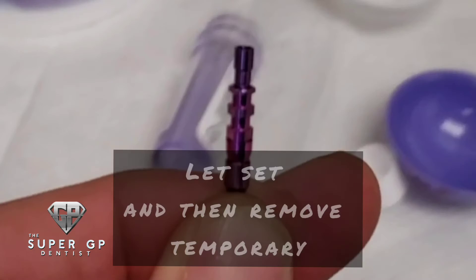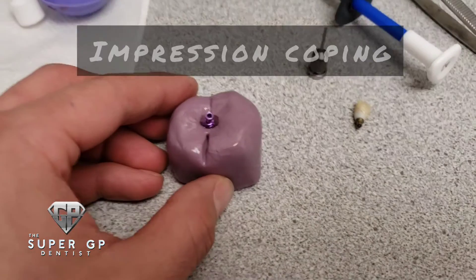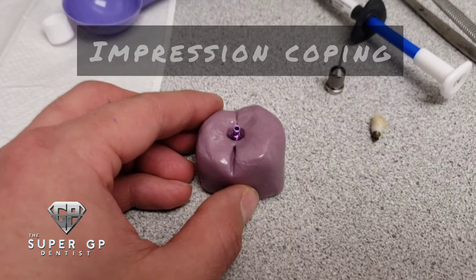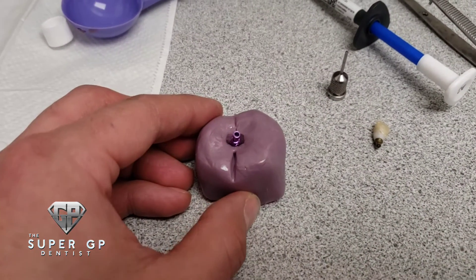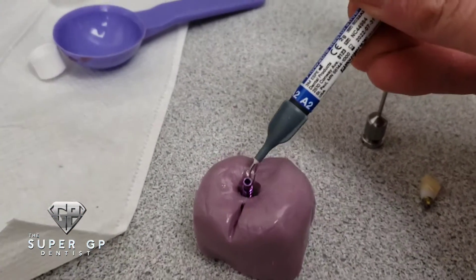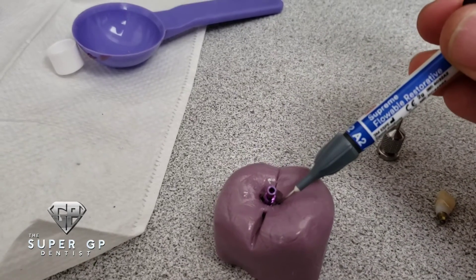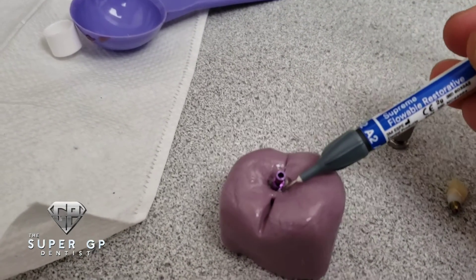Let everything set, then remove the temporary crown — the lab analog stays in place. Here we have the impression coping that we'll attach to the lab analog. You can see how tightly it fits onto the lab analog. I place the impression coping right onto the putty material with the lab analog in place.